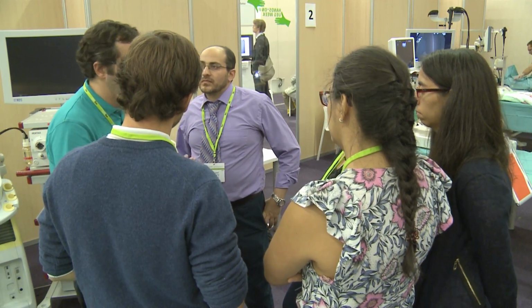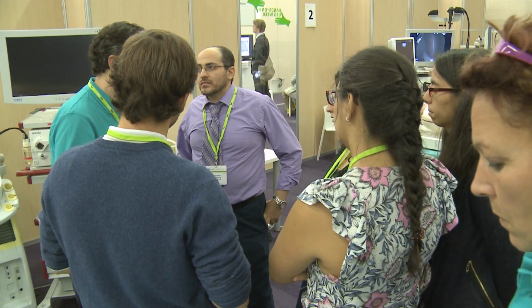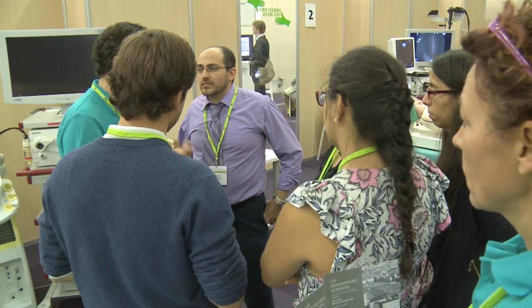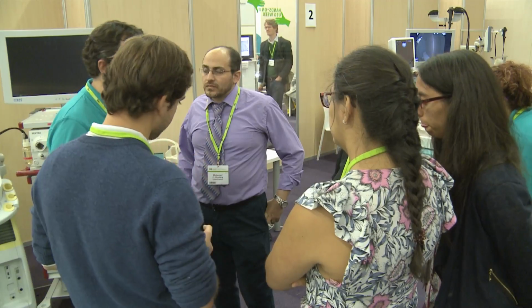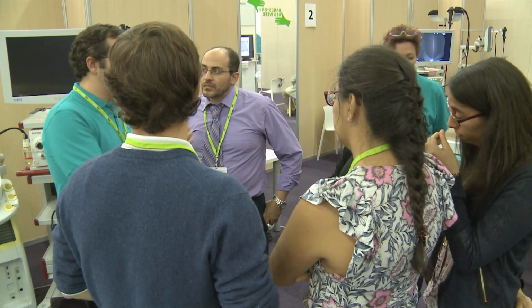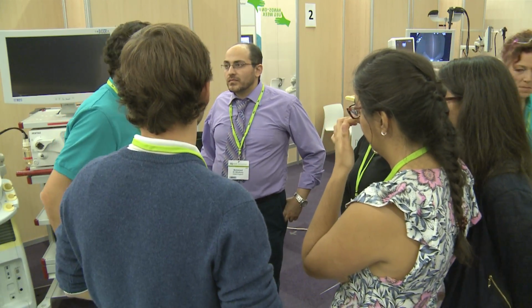If we want an FNA, I do an FNA. For those cases, I prefer to have the pathologist in the room because the rate of negative cases for subepithelial lesions is very high. So that's one of the few indications today. I want to have the pathologist with me while I'm doing the case. But the workup of subepithelial lesions is a nightmare, a complete nightmare, because we start to have a lot of requests for 8 millimeter subepithelial lesions. A nightmare. I don't like those cases at all, but we need to do them.